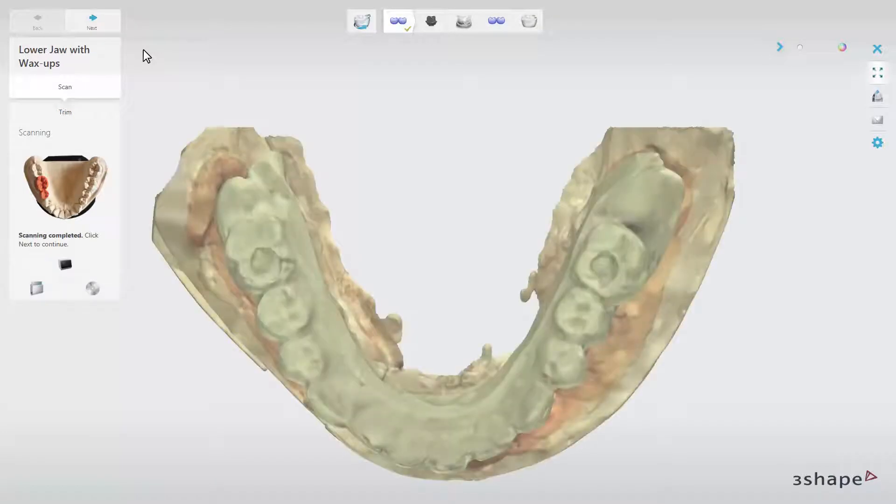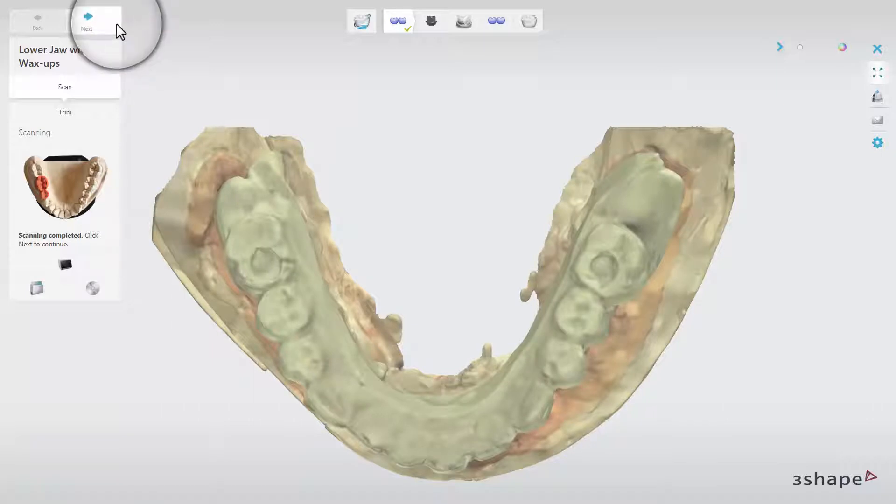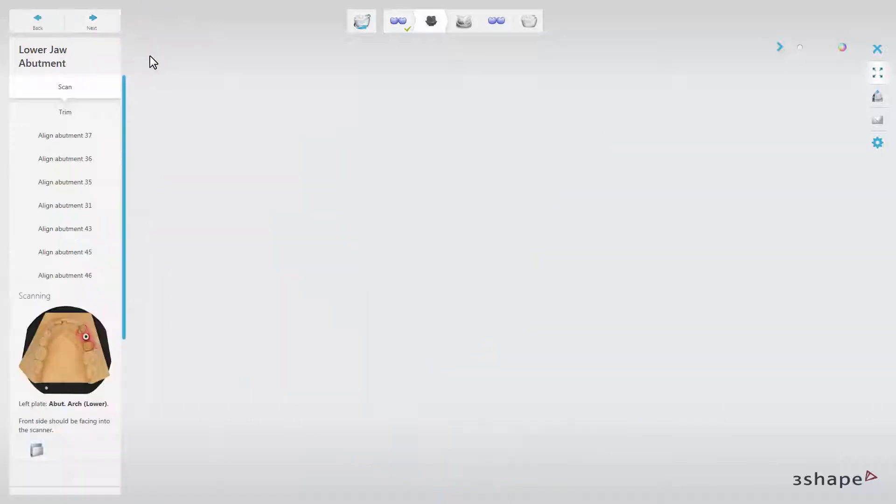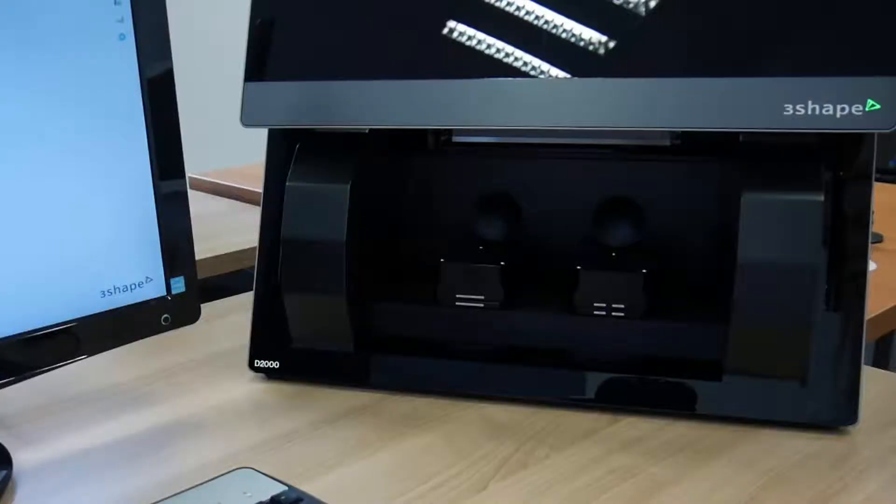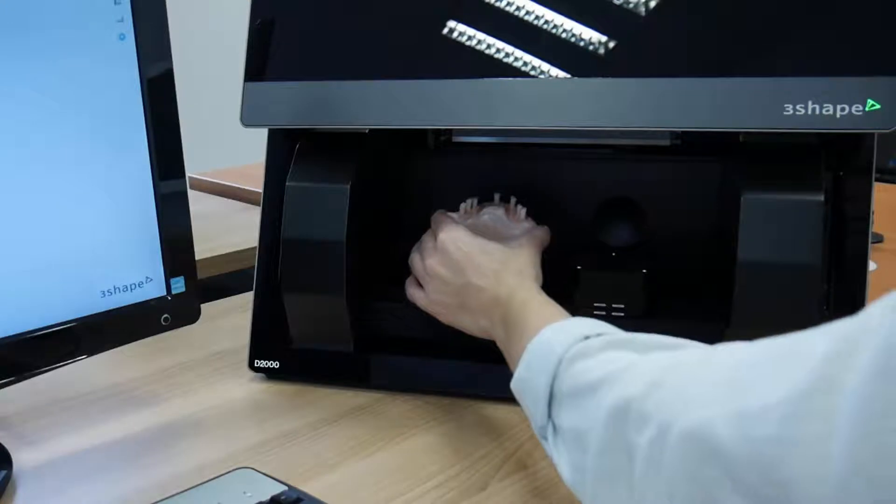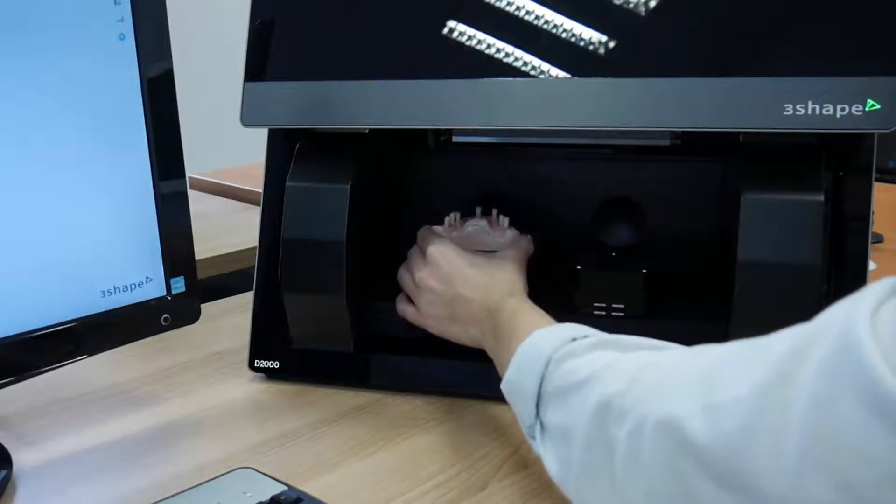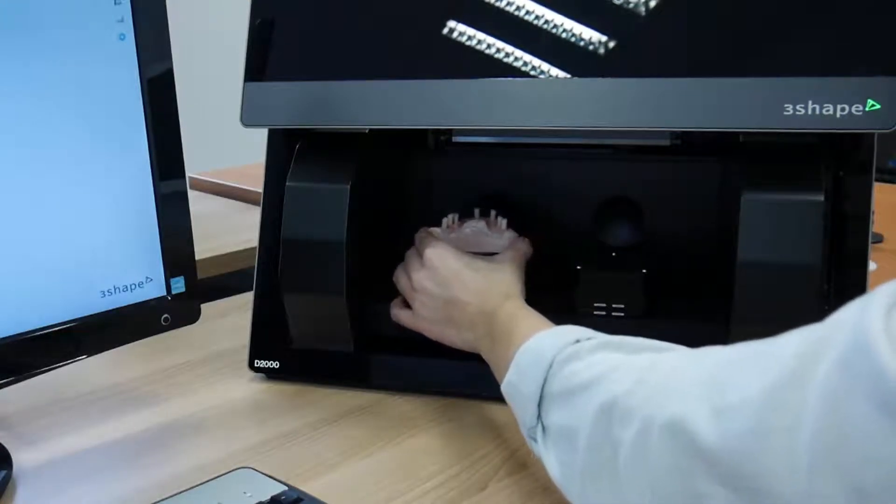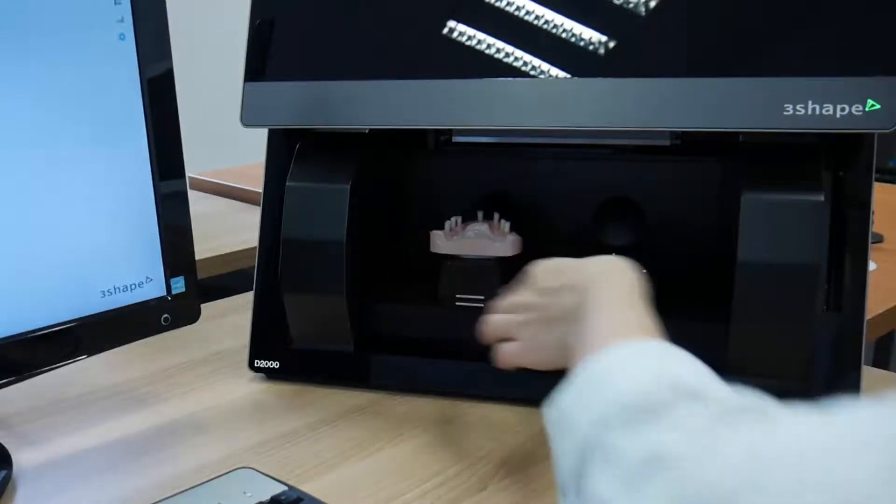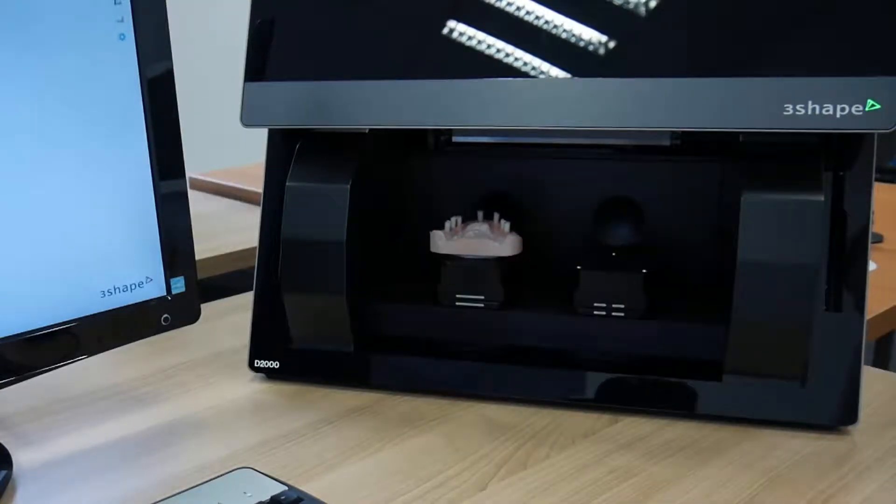Once scanning of the lower jaw is completed, click Next to proceed to the next step. Now, take the model out of the scanner, screw in the scan abutments, and insert the model into the scanner.